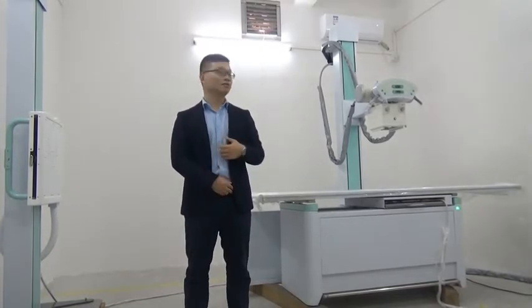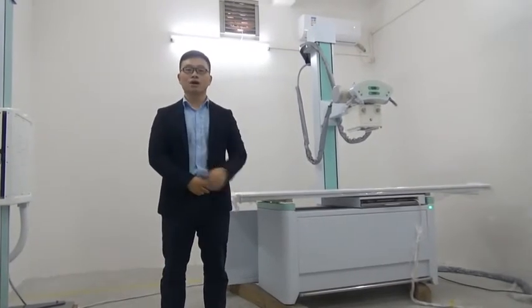Today I would like to introduce our PLD5600 digital radiography system. This system is mainly used for radiography of different body parts such as head, chest, abdomen, spine, and so on.